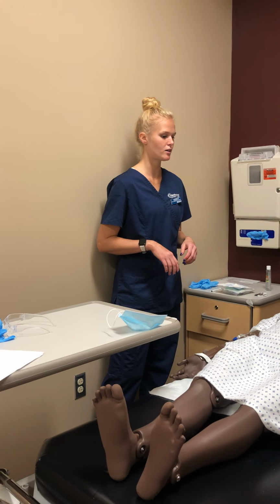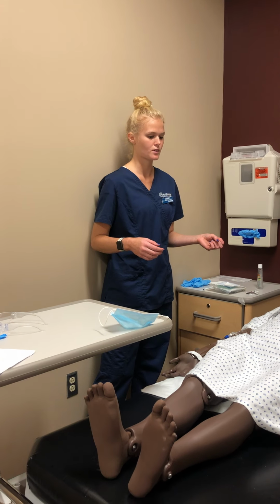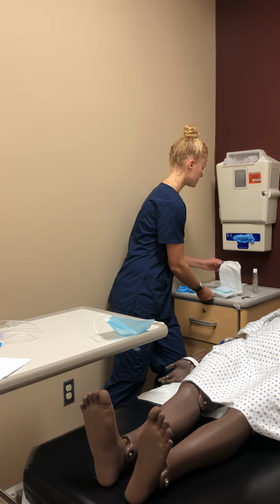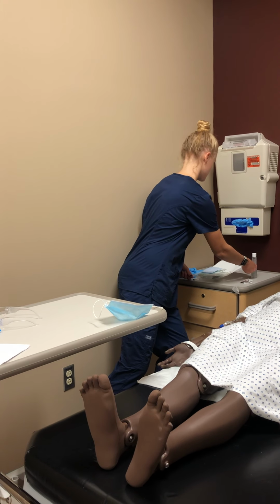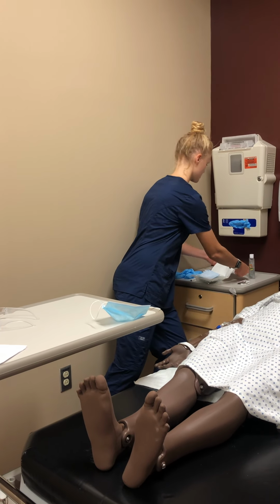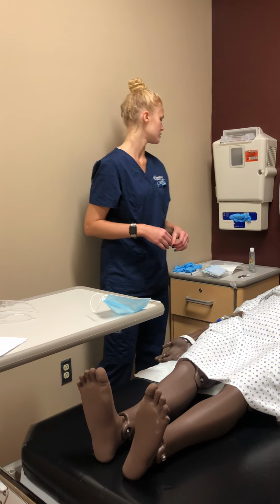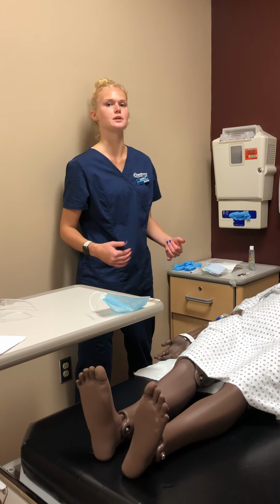If this was a fragile elderly patient, then I would be careful taking off the dressing. So what I'm going to do is wash my hands, and ensure that I get my sterile field. You don't want to reach over the sterile field. I did not reach over the sterile field just now. It should always be at waist level, so that's what we're going to do today.